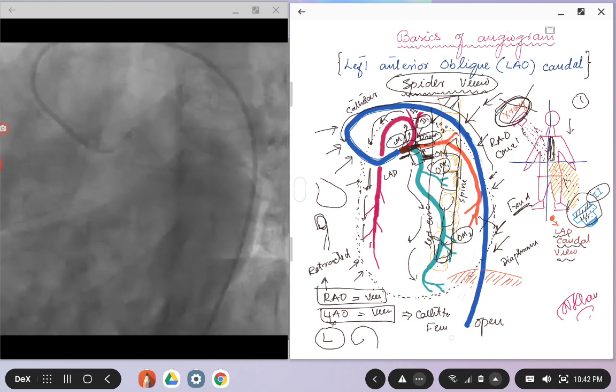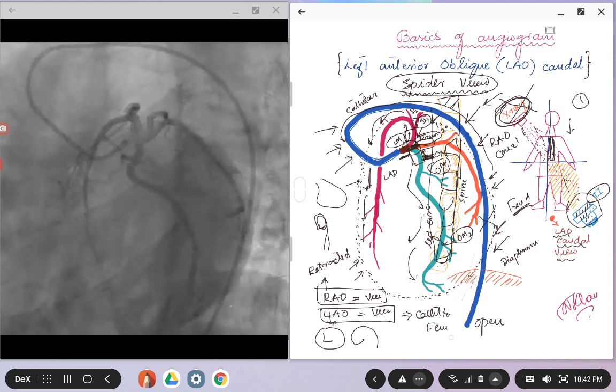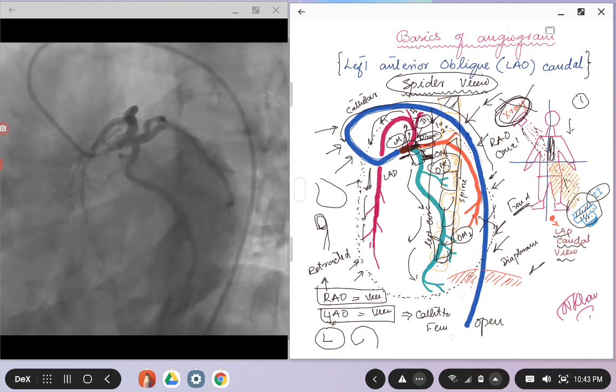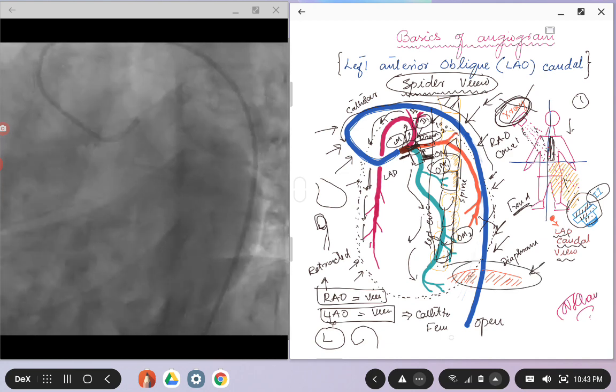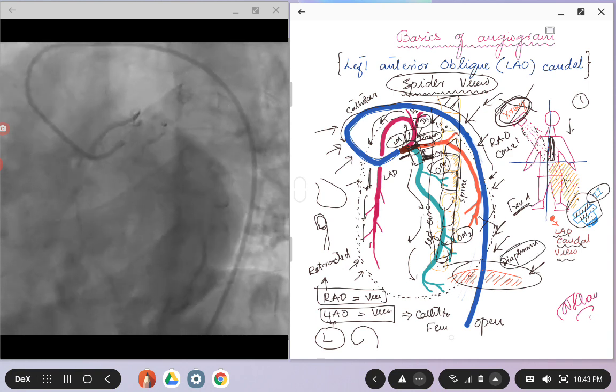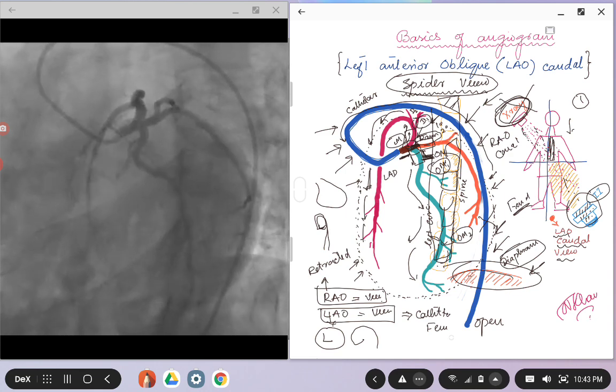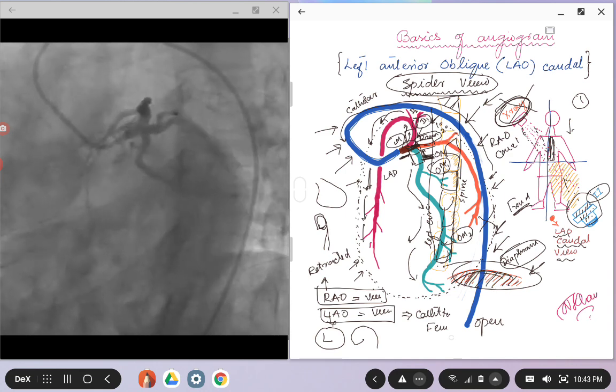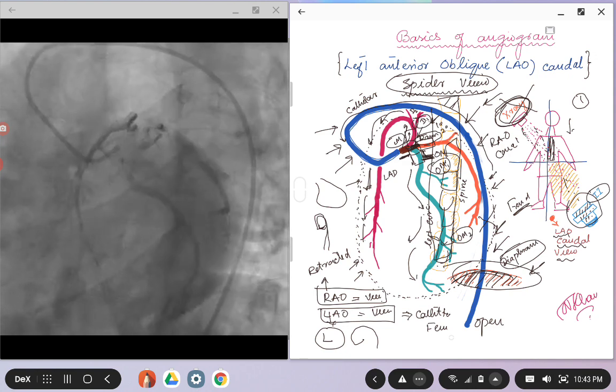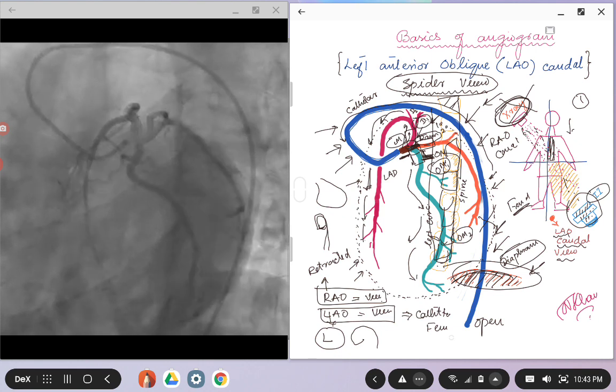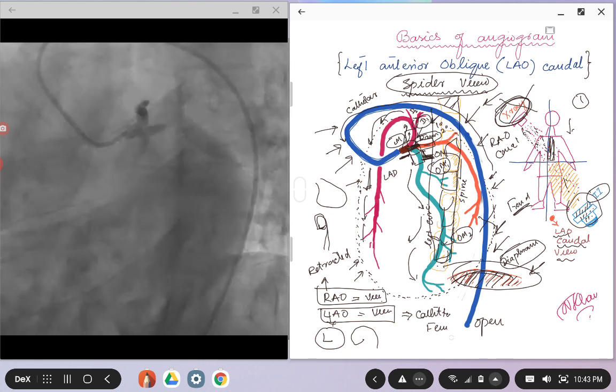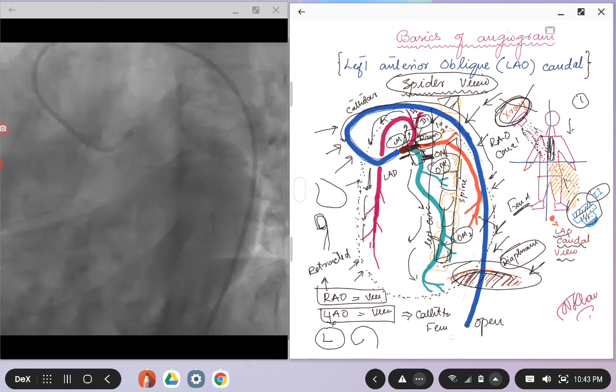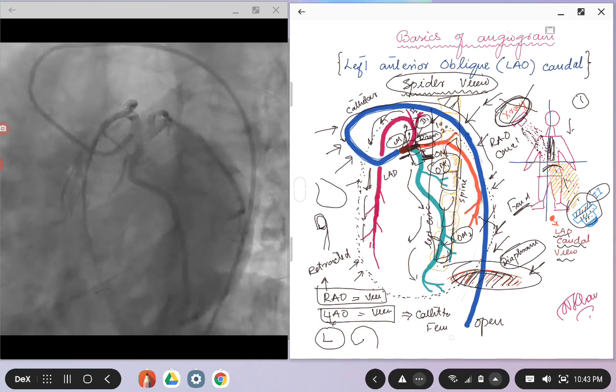Another important thing I want you to look at in the cine image on the left, and here I have kind of made it in the right lower quadrant, is your diaphragm. You can see a little bit of diaphragm coming up underneath the heart. But again, as we talked about in our previous talk, the x-ray image is coming from the top. It's not going to transverse the diaphragm. It's going to the heart first and then the diaphragm, so you might not see a whole lot of the diaphragm in the caudal views.